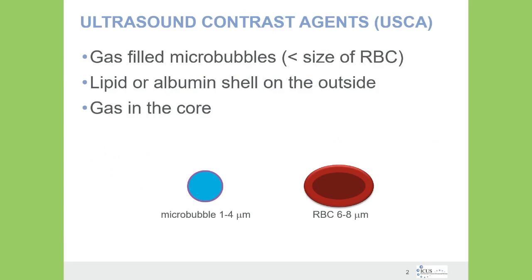Ultrasound contrast agents are gas-filled microbubbles that have a gas within the core and a lipid or an albumin shell. The exact composition depends upon the agent that is being used.